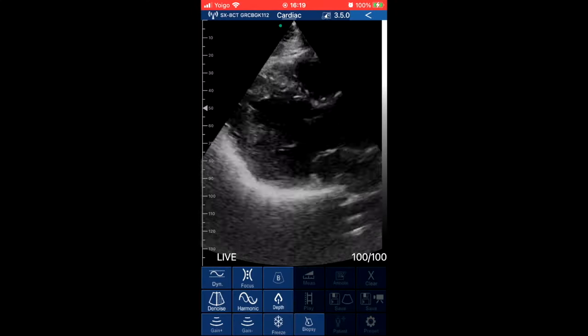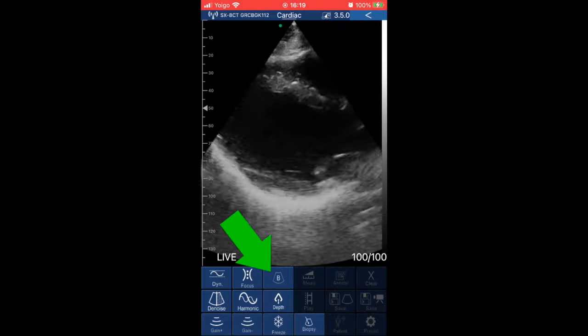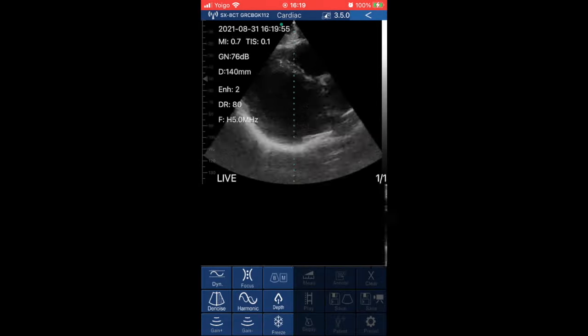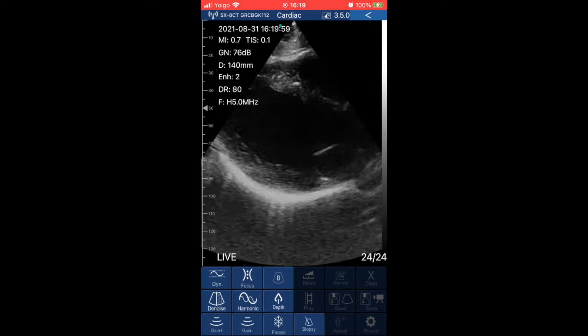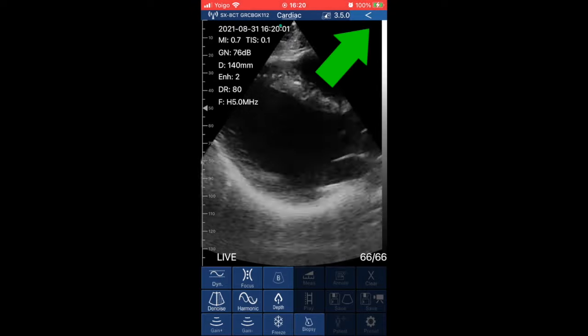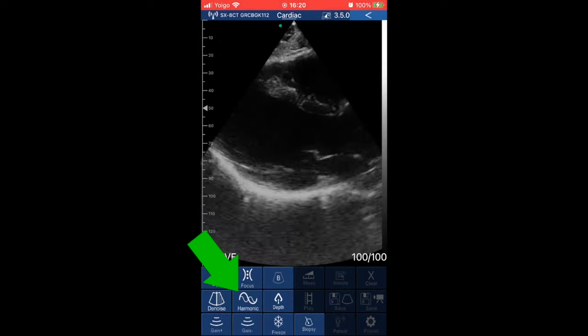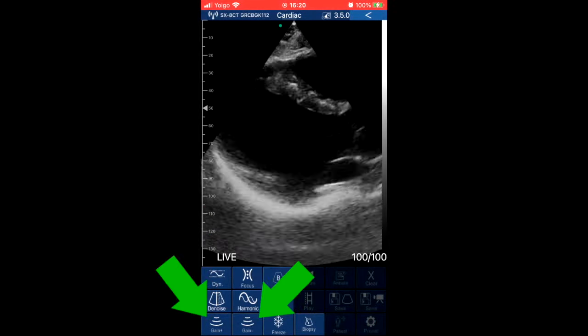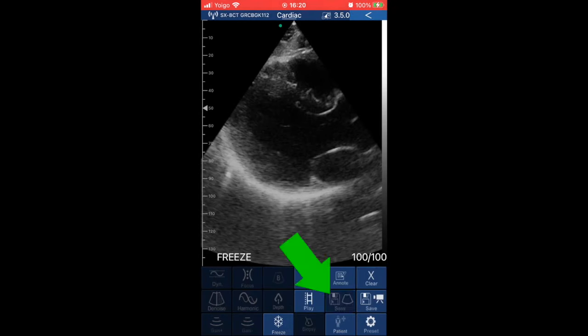This is the main screen. It has 15 presets for different organs, 5 imaging modes — B-mode, M-mode, Color Doppler, Power Doppler, and Pulse Wave Doppler — and several advanced image settings such as time gain compensation, dynamic range, focus, harmonic, and de-noise, as well as the typical depth and gain. It stores images directly on your device as JPG or AVI, and it can also use DICOM.